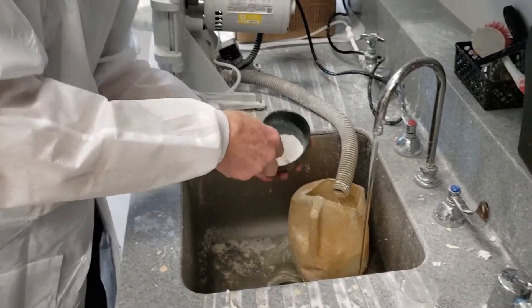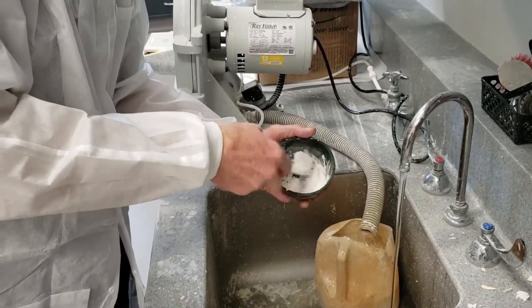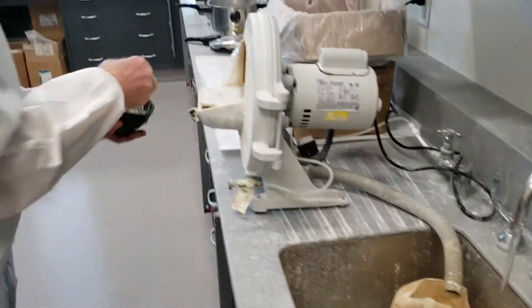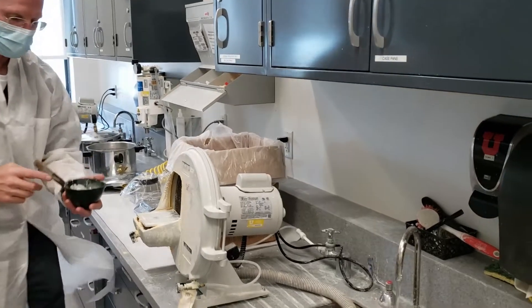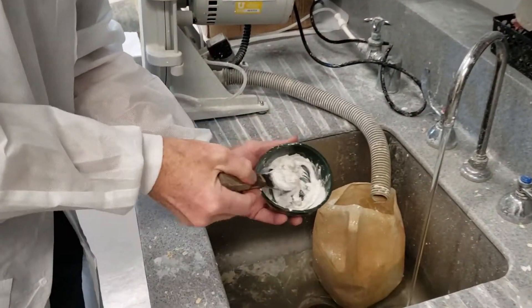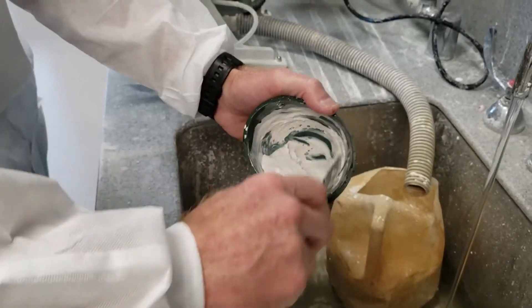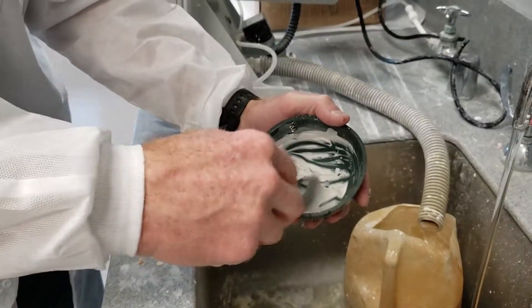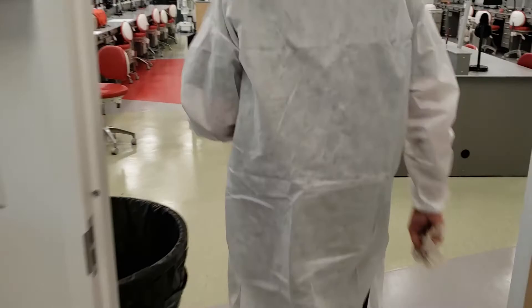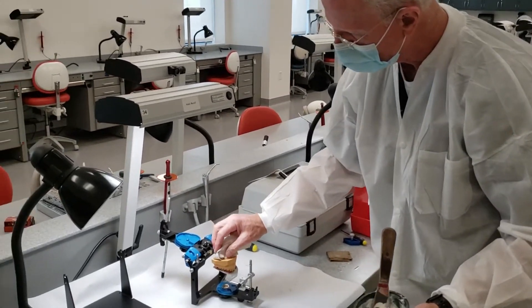We're going to add a little water — I probably added a little bit too much. So I'm going to come back and see how that is. You want some consistency to it so that it doesn't run. Dr. Lauder uses the term 'peanut butter consistency' — I think that's a good description. Then we're going to take a dry paper towel with us, because you don't want any puddles of water on your stone cast.